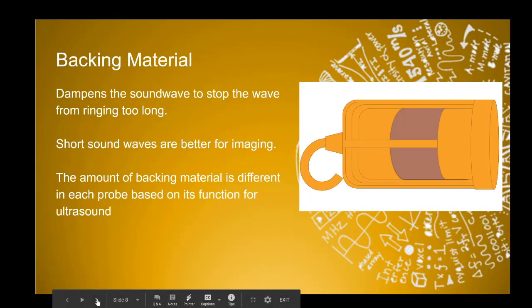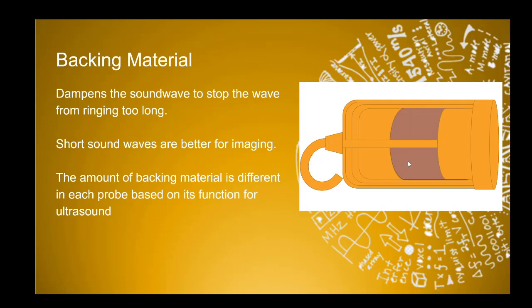Moving on, then we have the backing material, and the backing material sits behind the PZT crystal. And the whole job of the backing material is to dampen the sound wave to stop it from ringing for too long. We know that short pulses improve our imaging. So a short sound wave is going to be better.